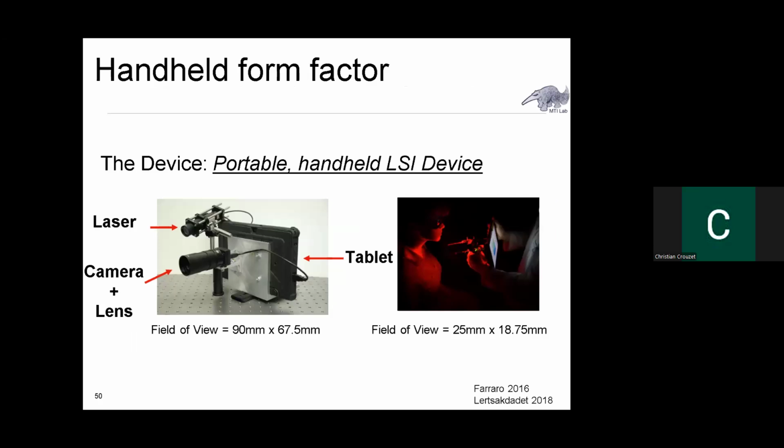So one thing that Bernard and previous grad students started doing was miniaturizing that huge cart-based system and having it in just a handheld format, where you're able to attach a laser and the camera and lens to a surface.